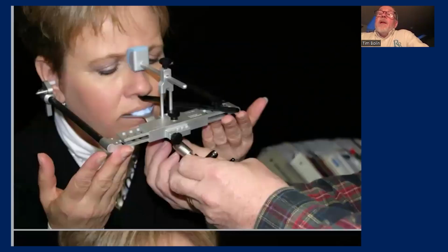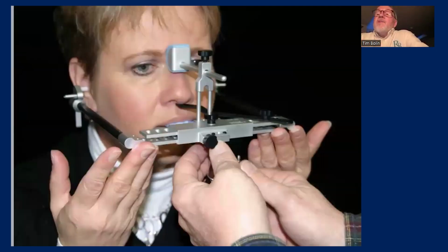Right now the slide is showing it being attached to the bite fork, and this slide shows it being attached to the transfer bow. Once I've got that in there, my right hand is on a thumb set screw that is tightened down quite tightly. We don't want that set screw to move. You might feel you're going to over tighten it, but don't worry about that. As long as we can loosen it up when we need to, we're in good shape. We don't want to lose that position during transportation, transfer to the laboratory, or any step along the way. So we're going to make sure that's quite tight.